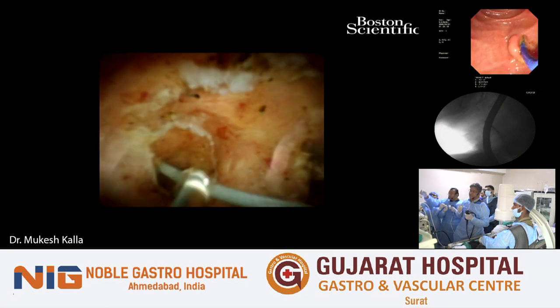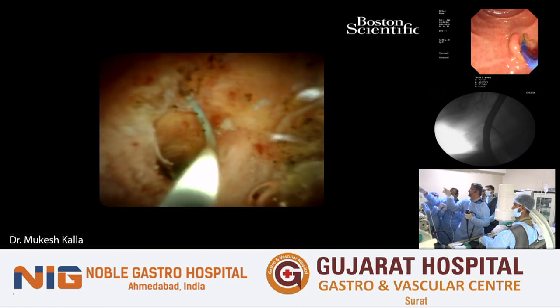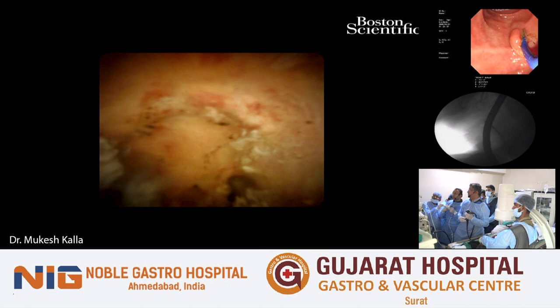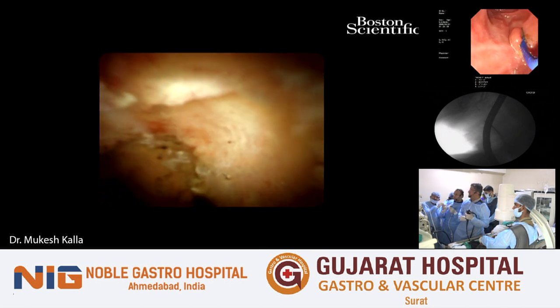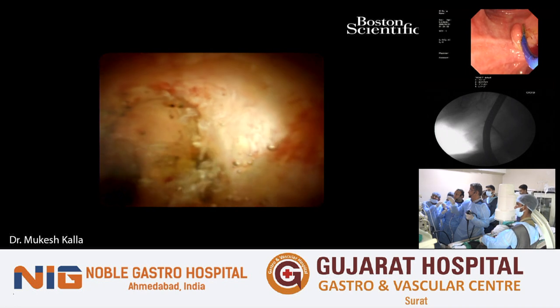We can do a stenting. This is cystic duct. I agree. We'll go this side. Irrigating. So, if there is acute angulation of the cystic duct, common bile duct junction, even cholangioscopy would fail there.